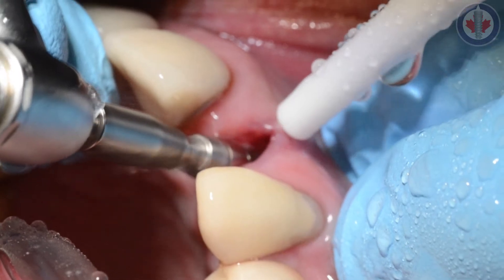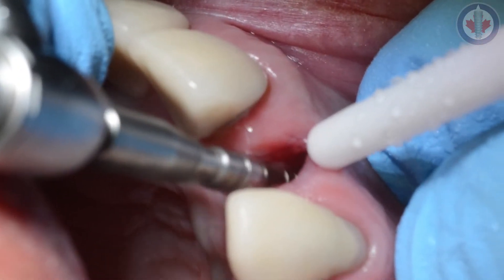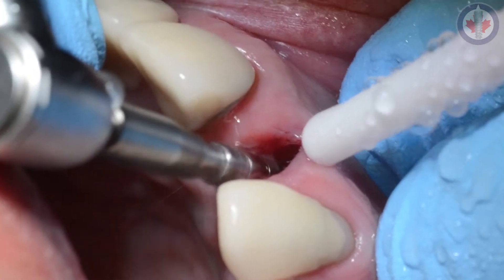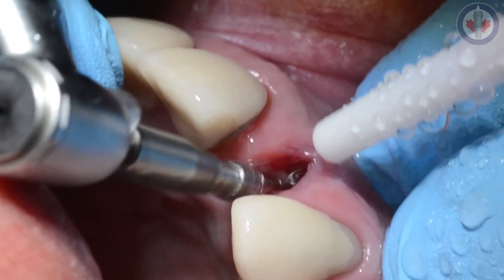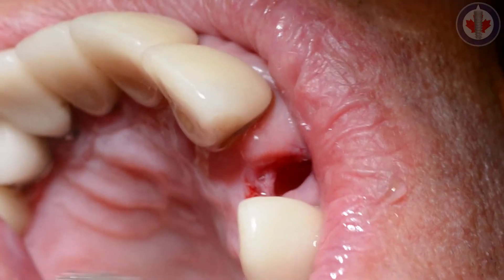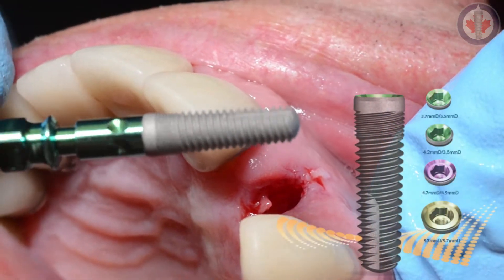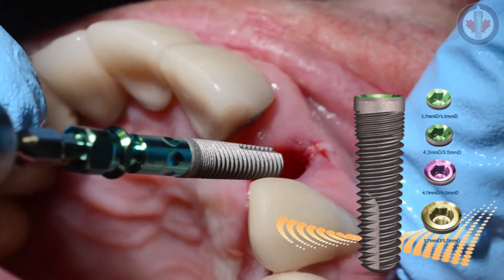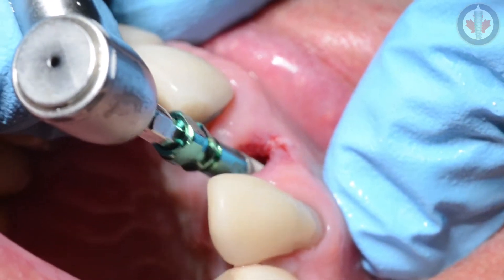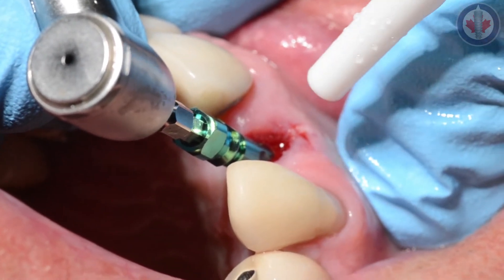Continuing along with the assortment of implant drills, progressively moving from the pilot drill to the 2.8 to the 3.4 mm. We're using an Implant Direct Legacy 1 implant here. This implant is very similar to the Zimmer tapered screw vent. It was actually invented by Jerry Nisnik who, through his company, offers a number of widths: 3.7, 4.2, 4.7, 5.7, and they even have a 7.0 available — not in the Legacy 1 but in their product assortment.